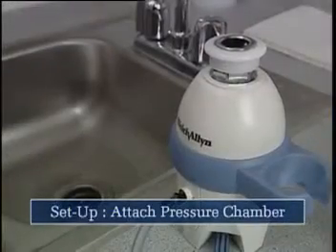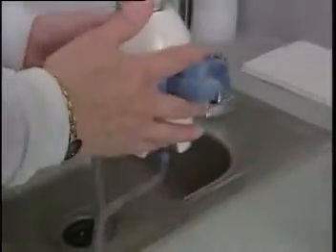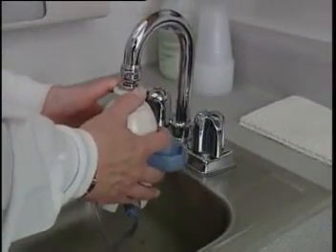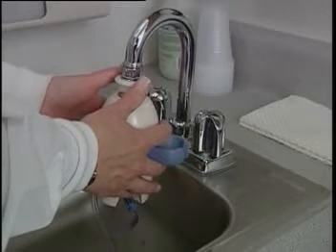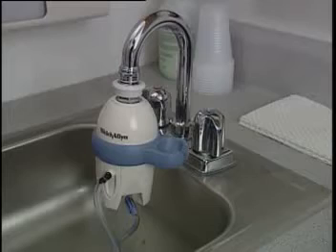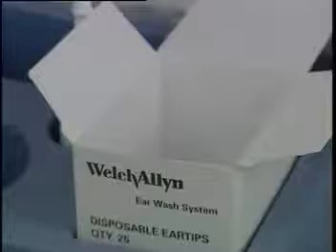To attach the pressure chamber to the faucet, pull down the white plastic ring on the top of the chamber and attach the chamber onto the snap aerator. When the unit is firmly in place, release the white plastic ring. The unit should now be securely attached to your faucet.